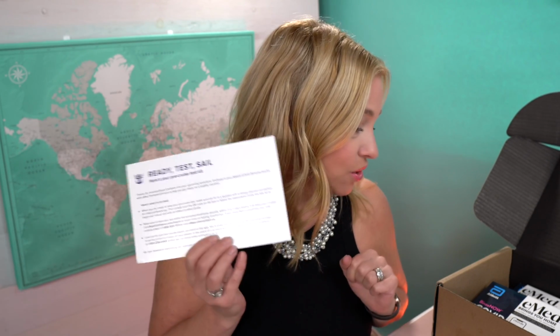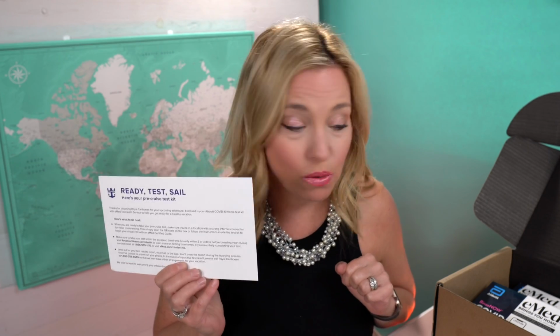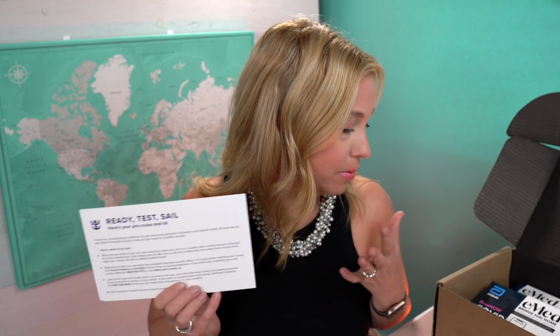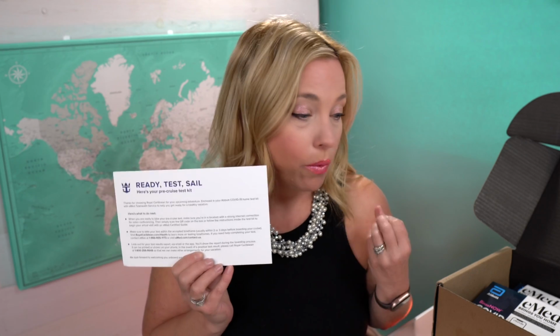One thing they don't tell you that you need to do when you get this is that you need to have your identification out, your photo ID, and you also need to create an account with a company called Navica, who partners with eMed and Abbott for the BinaxNOW home test. So I went ahead and grabbed my photo ID, and I already created my Navica account so that I didn't have to go through that whole process with you. It's a very simple account setup. It asks you for your name, your address, your date of birth, and very little other information. That was really quick. You also have to set up a username and of course a password with Navica as well.